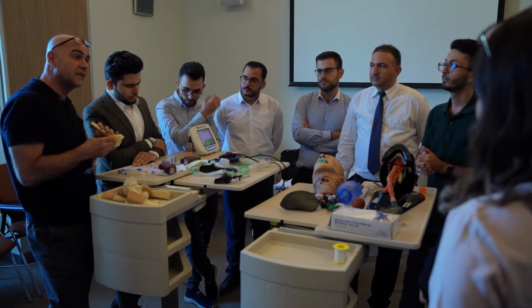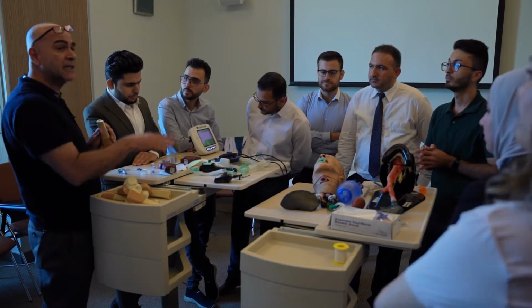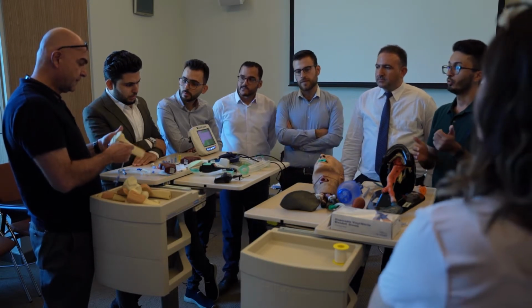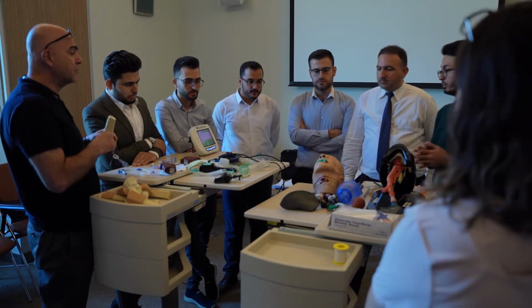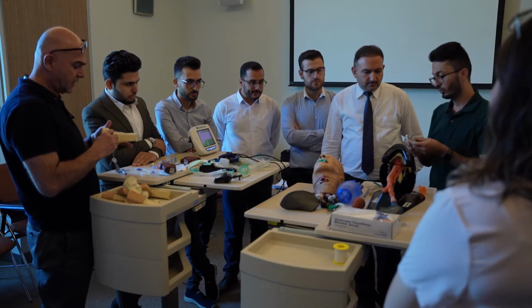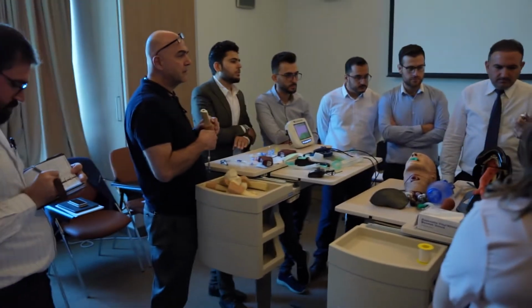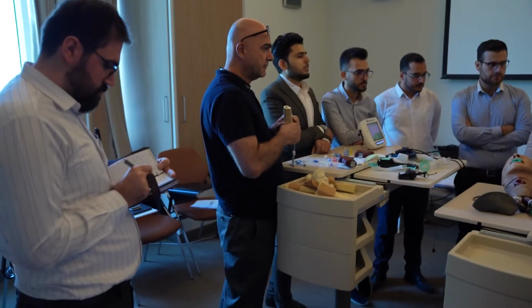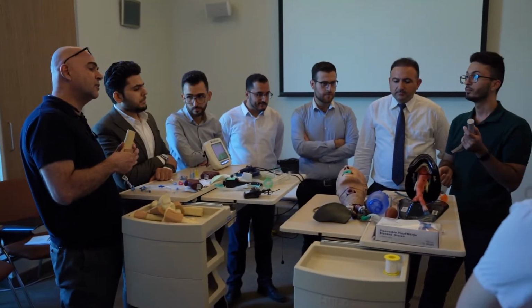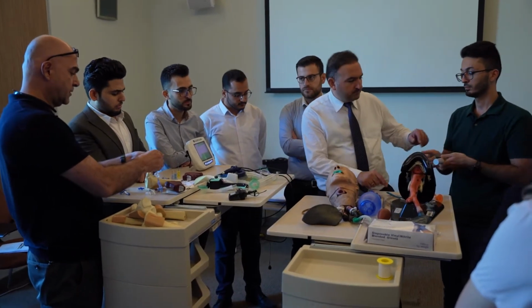So what is the definitive procedure? Any patient who tolerates an oropharyngeal airway definitely needs intubation. What are the devices you need for intubation? Laryngoscope. Good. Show us how you are going to use it, handle it, and tell us the parts of the laryngoscope. This is the blade. Good. This is the handle. Actually, this should detach. Okay, good. Excellent. And there is a light working, that's it. And this is the way you are going to handle it, and tell them, Dr. Firas, how they do intubation.